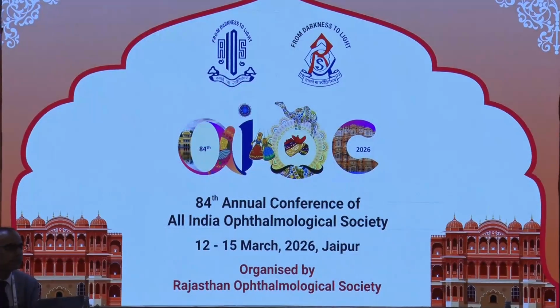Thank you, Dr. Agender. Because the hardest cataract he has shown cannot be done by a simple chopper. You have to use a very sharp chopper or a long edge chopper. But with this chopper he is using, it's an advantage that at the tip there is a blunt area, so chances of posterior capsule damage are very less. But definitely, when there is a hard cataract, there is less space in the periphery. So how would you suggest you pull the lens?